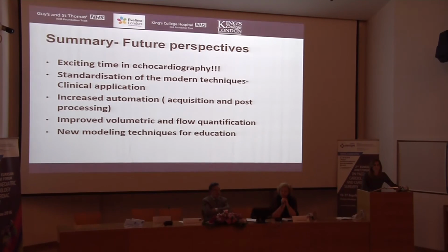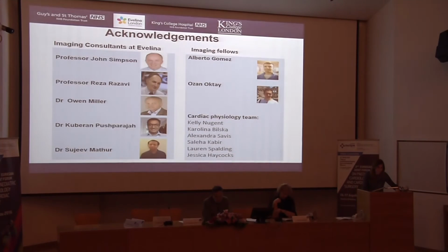Now, we have the development of other new modeling techniques. In our department, we have instigated holography, but I cannot really show you any images as yet, which we can use for education and for surgical planning.